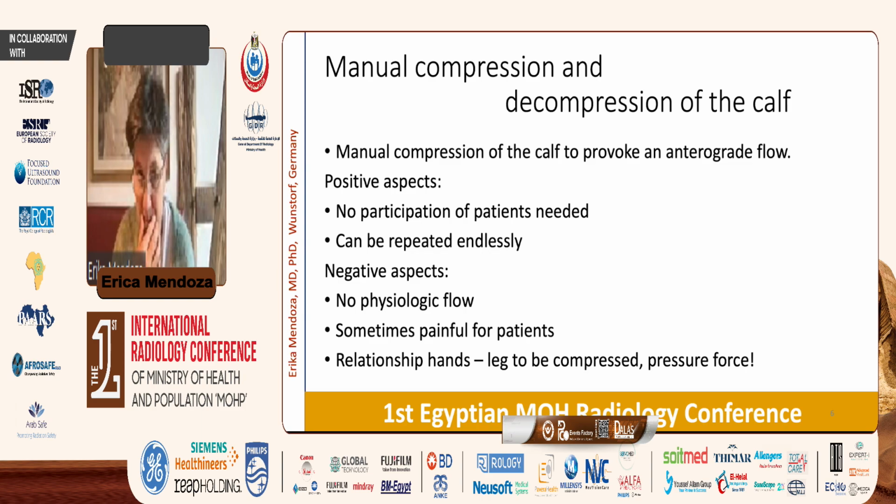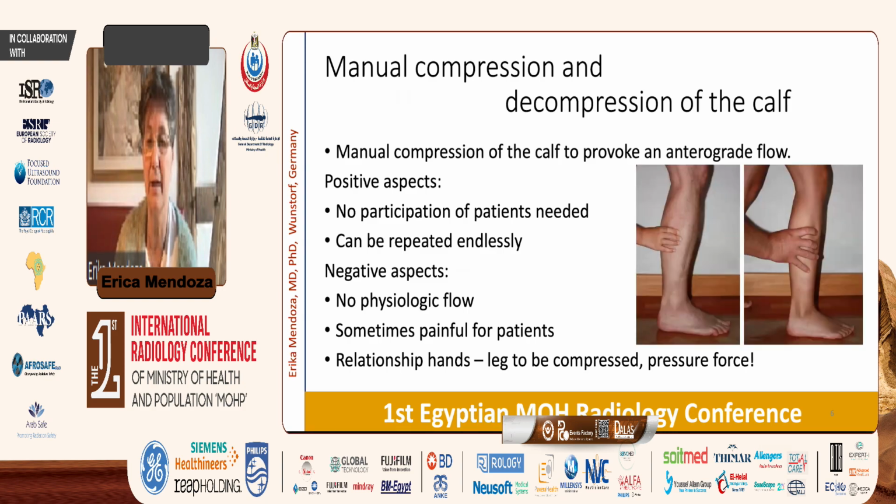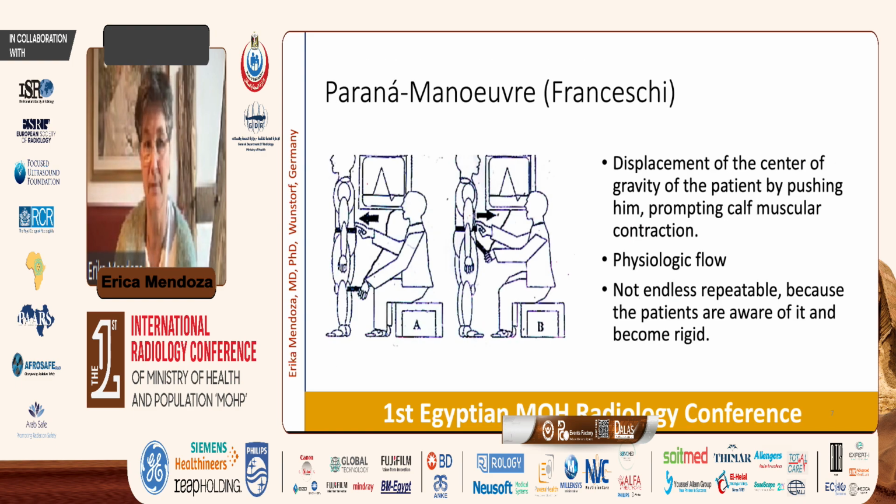But it is not a physiologic flow, and sometimes if there is pain in the calf, it is painful, and it depends on the relationship between hand and leg. Like this example, my daughter pressing my husband's leg and my husband pressing my daughter's leg. Of course, the bigger the hand in relation to the leg, the more flow you will express, and possibly in this case you won't have any flow. So you have to be aware of the problems the maneuver could have in practical cases.